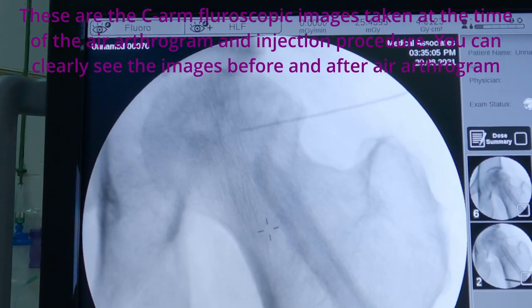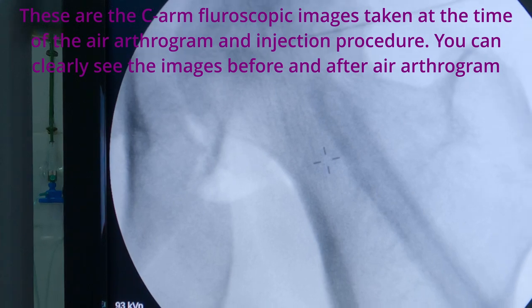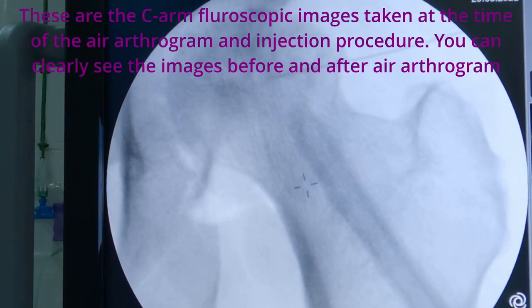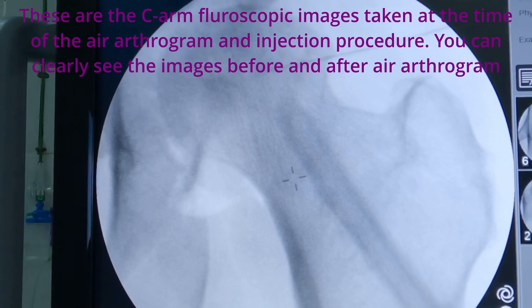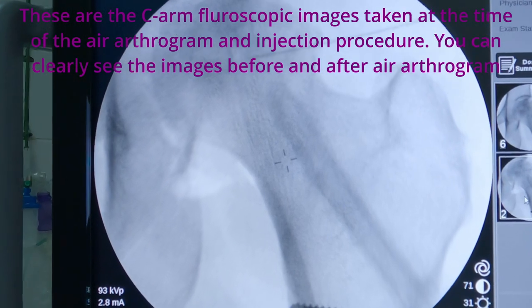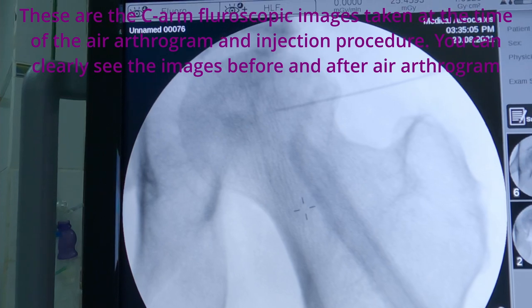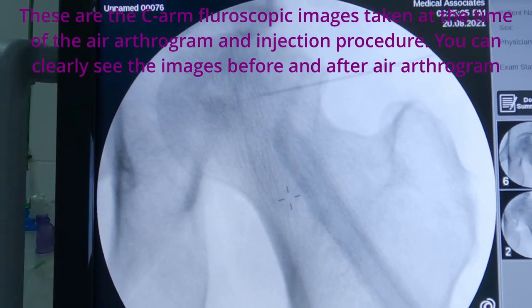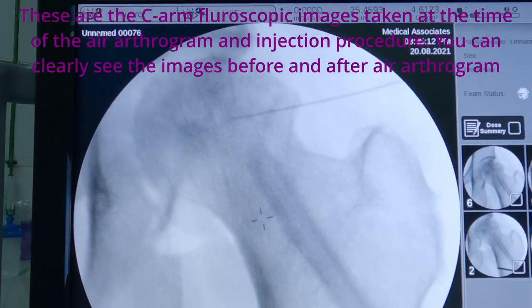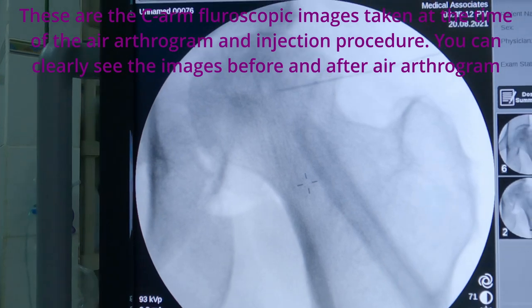The air arthrogram will help to avoid injecting iodine-based radio-opaque contrasts, and hence prevent complications such as severe allergic reactions as well as iodine-induced synovitis. Studies have shown that the air arthrogram injection procedure is as successful as iodine-based contrast injection procedures, with fewer complications.